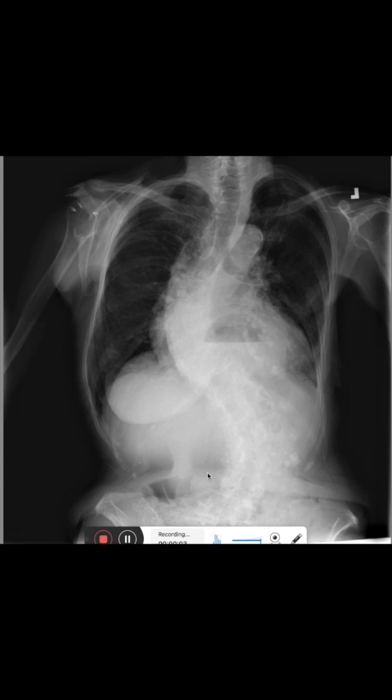Hello and welcome to this channel. In this video we want to have a look at this chest x-ray. So first, what do we notice?